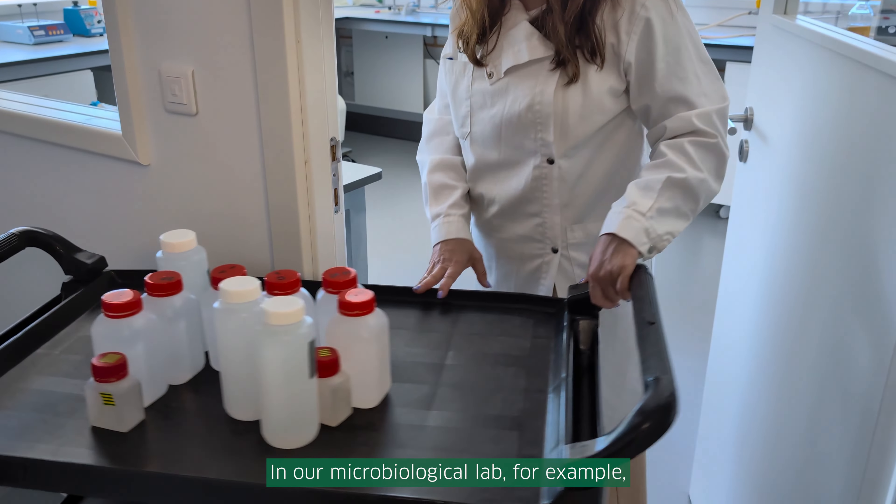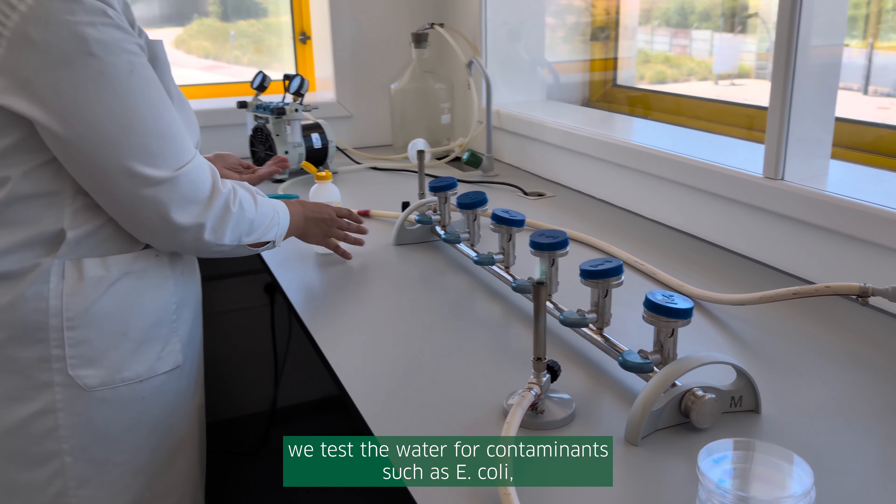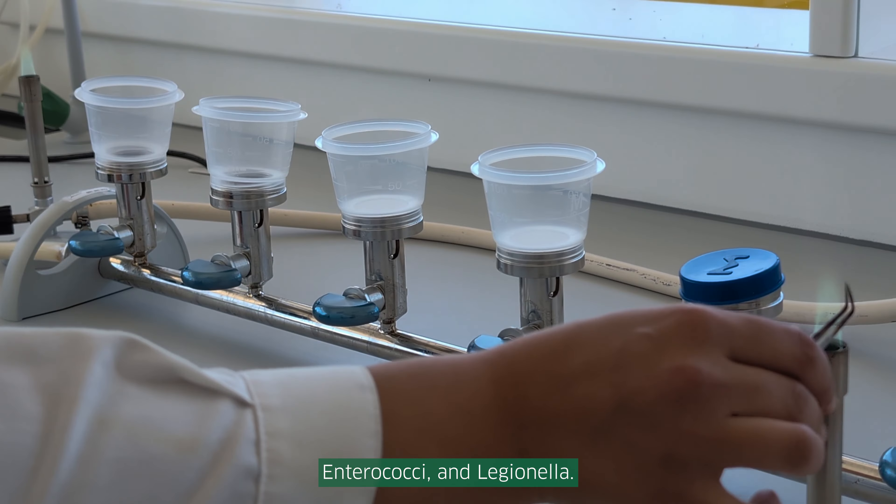In our microbiological lab, for example, we test the water for contaminants such as E. coli, Enterococci and Legionella.